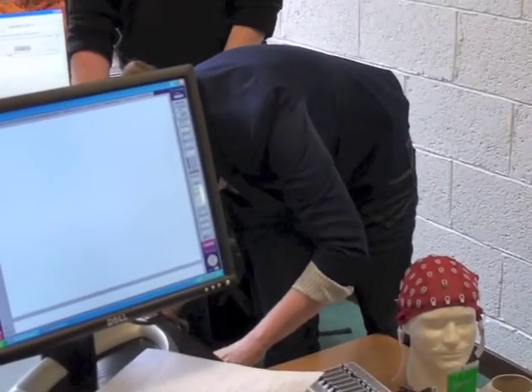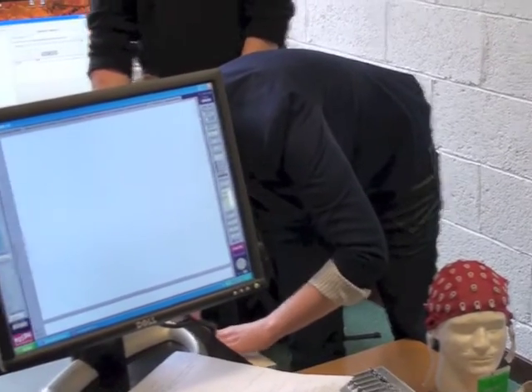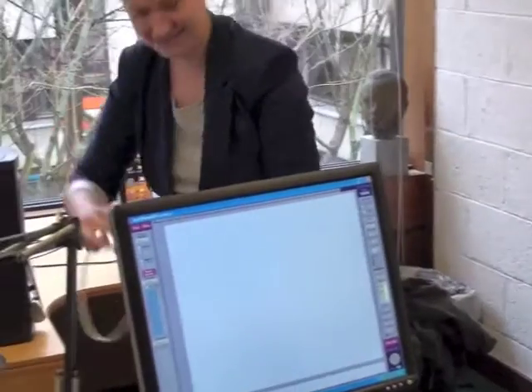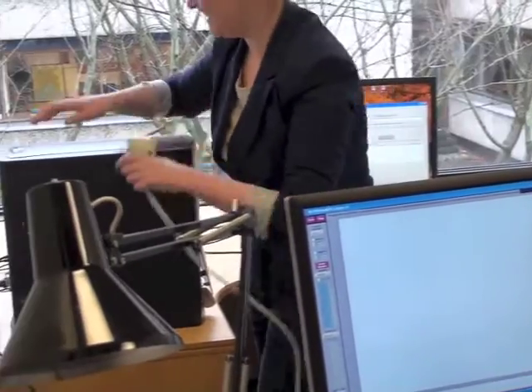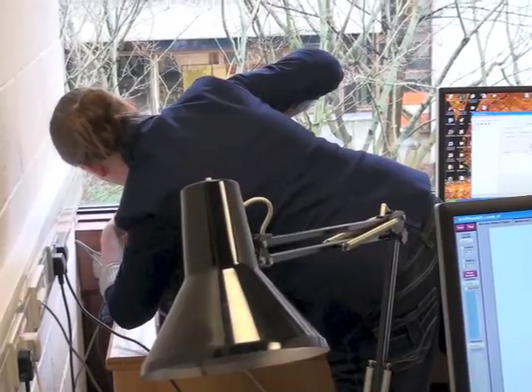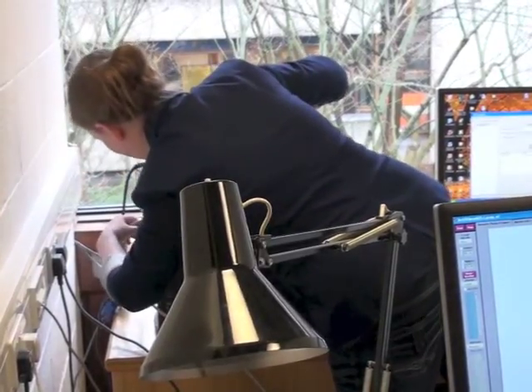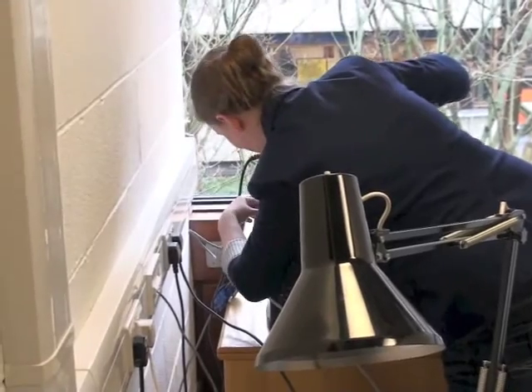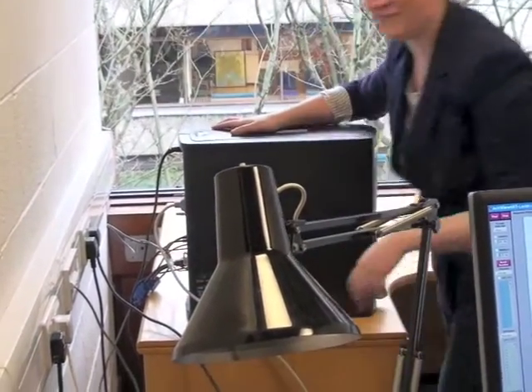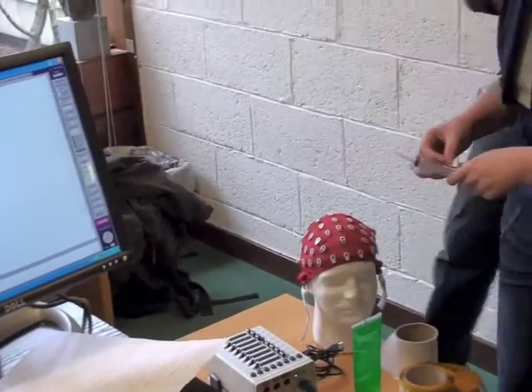Does anyone want to tell any filler jokes while I'm doing this? Jeez, you're worse than my students. We're not talking. Okay. Have you no EEG jokes? No. I don't know if there are any. An EEG machine and an fMRI machine walk into a bar. But I don't know. And the fMRI goes, have you got the time? There you go. You just went 5 stars.